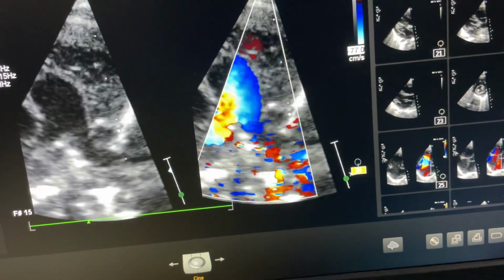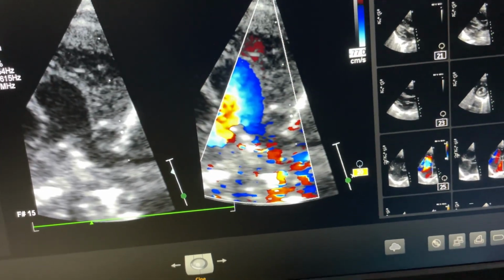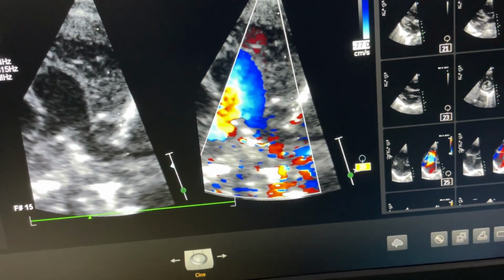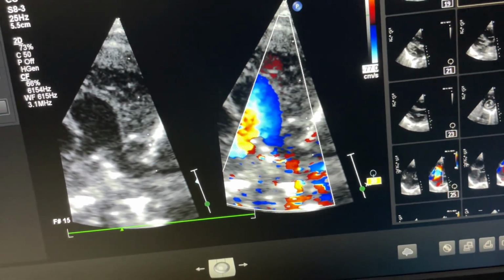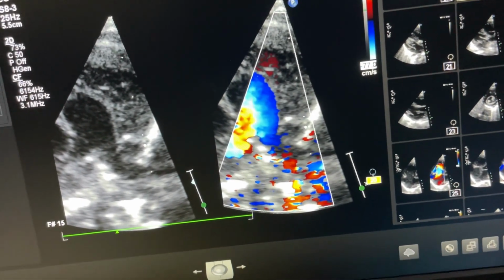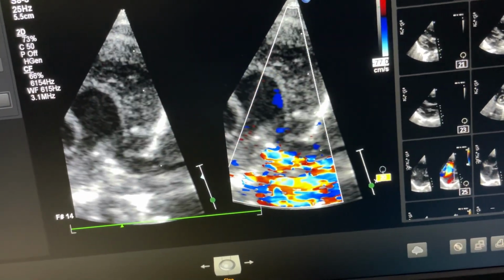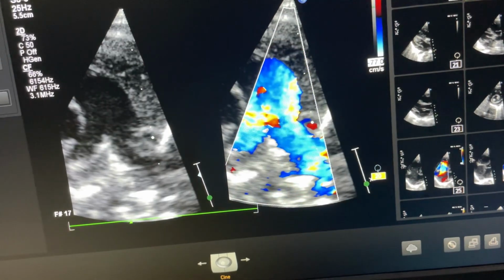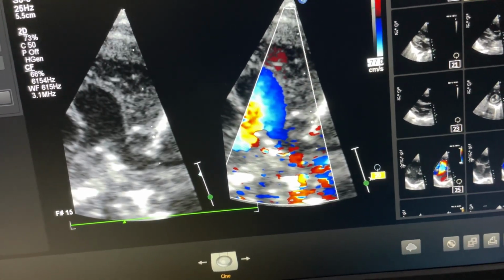So ultimately, suprasternal view will give you how the left-sided vena cava is draining, whether left-sided vena cava is present or not. Suprasternal view will give you a better picture, but even in parasternal short axis view you can get this if the part of coronary sinus is coming anterior to left pulmonary artery branch.